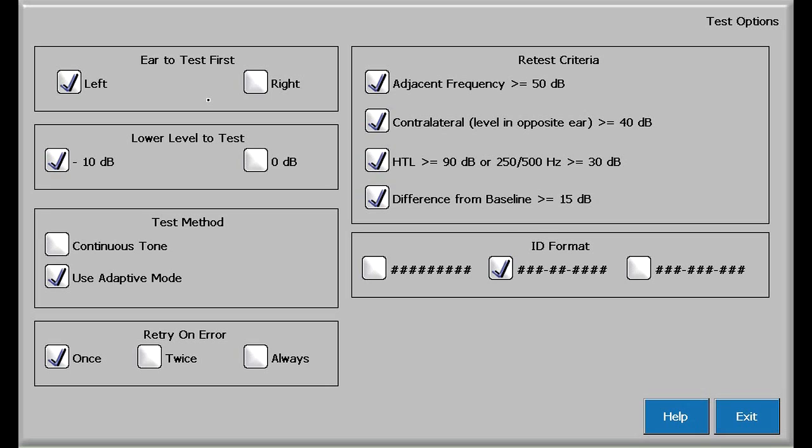In the upper left hand corner of the display, you can select which ear to test first. Left is the default. Next, you can select the lowest level to test option. The default is minus 10, but many users select zero, which typically results in a faster test.